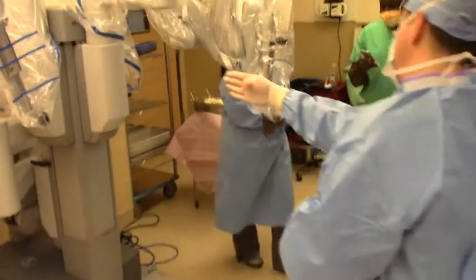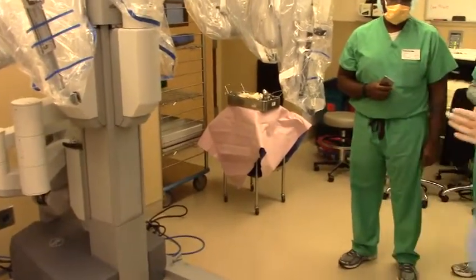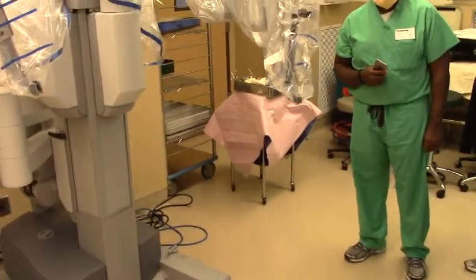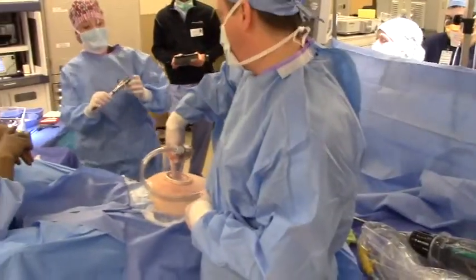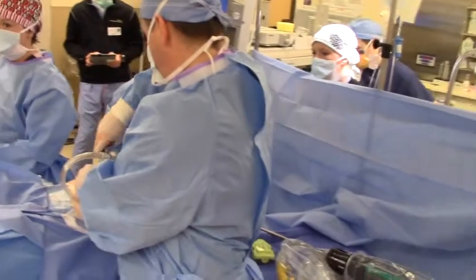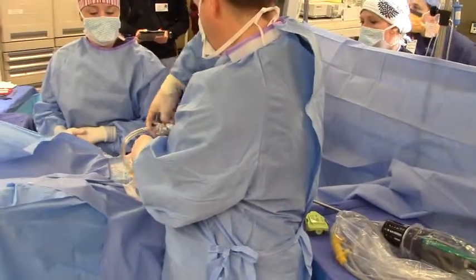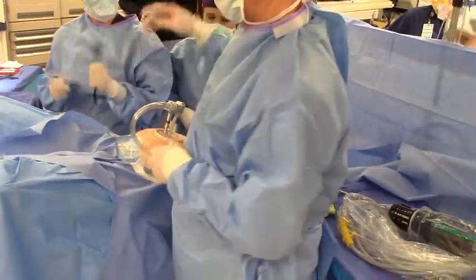And then the nurse, all she has to do is sight off the left side of the tower, and she's putting it in. She's basically going to draw a line from where she is all the way down. She's going to aim — I'm going to put a hand right here. We'll have the camera point in to the top right at the edge, over the gel port.